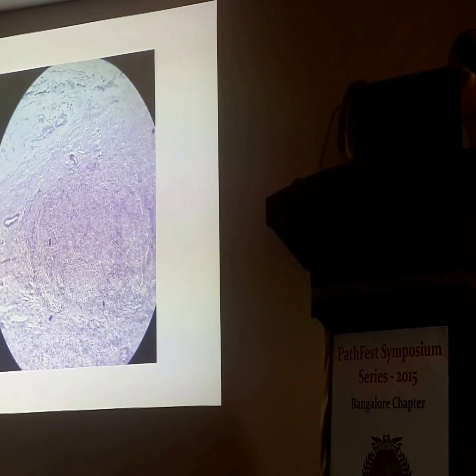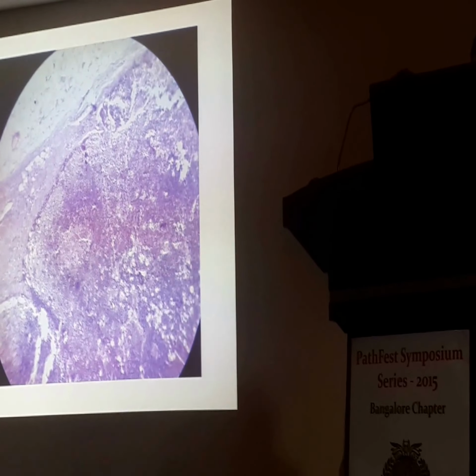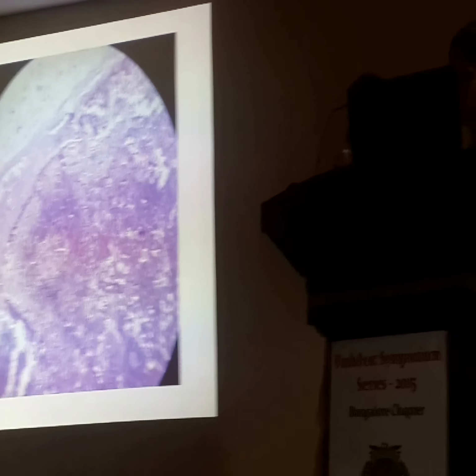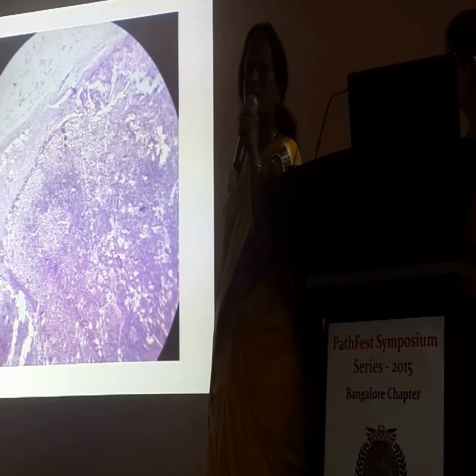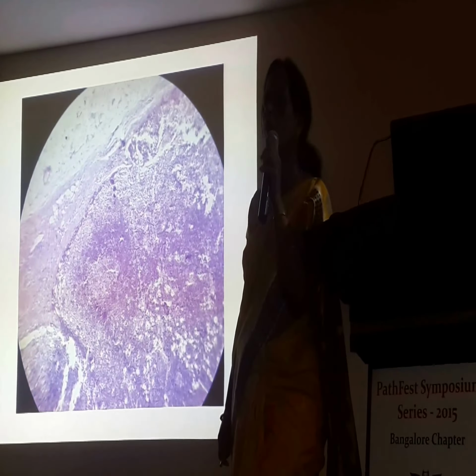Very difficult, it's just a low power. Yeah, we are convinced it is a lymph node by the low power appearance. That was scanner, this is low power. You are just looking at the lymph node. Lymph node pathology is easy?